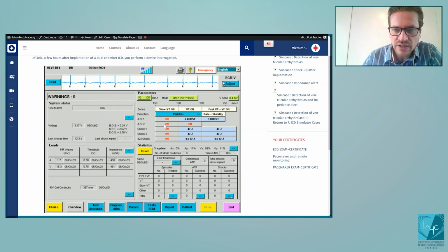So this is a paced impedance, which is a bit higher, but it's normal for this brand. And then on the right, you will have even more information. You will have the lower rate and the upper tracking rate. You will have the pacing mode, which is here the SAFER mode, which is very similar to VP suppression in Biotronik, or MVP in Medtronic, or VIP in Abbott devices, or Rhythm IQ in Boston. So we have the pacing mode, which tries to avoid unnecessary RV pacing, which is also available in ICDs.